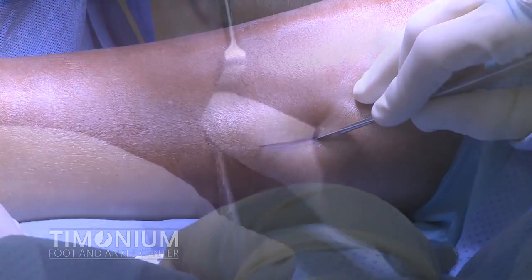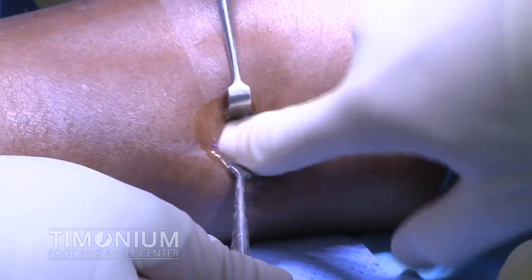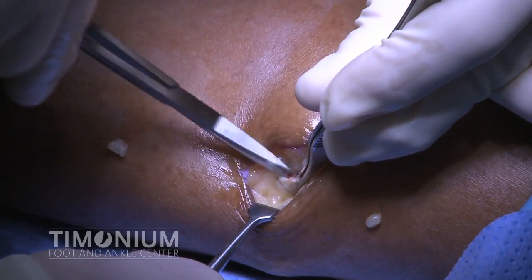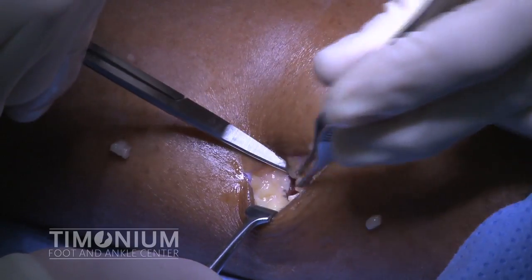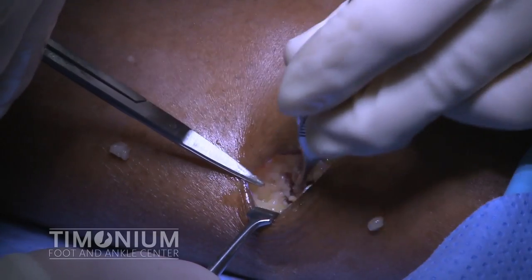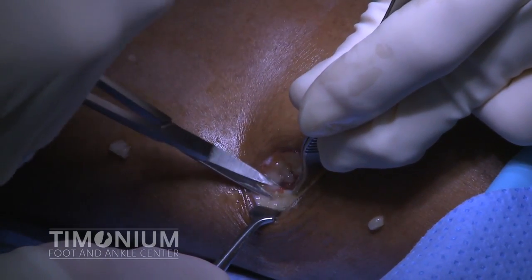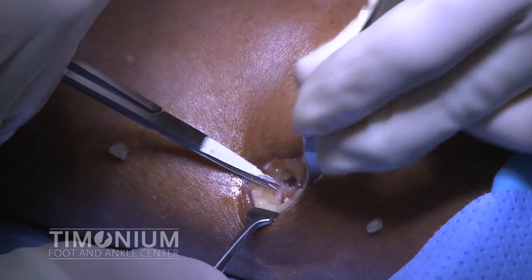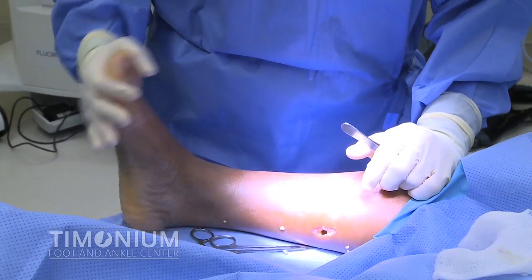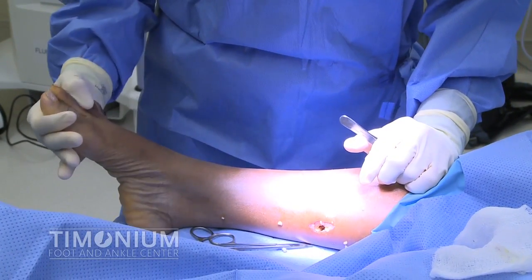I make the skin incision along the medial calf and use my finger to feel my way down to the shiny white gastrocnemius aponeurosis. I then grasp the aponeurosis and cut it from medial to lateral. As the tissue is cut, the underlying muscle is exposed. The foot now easily dorsiflexes to above 10 degrees at the ankle with the knee straight.